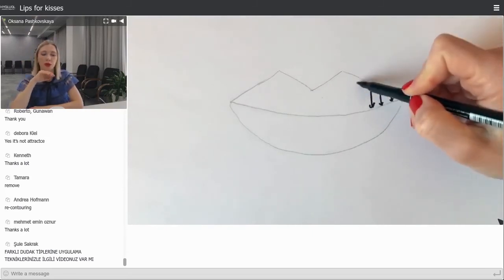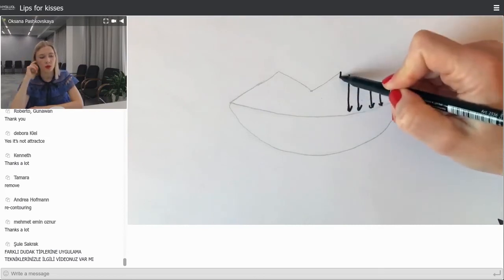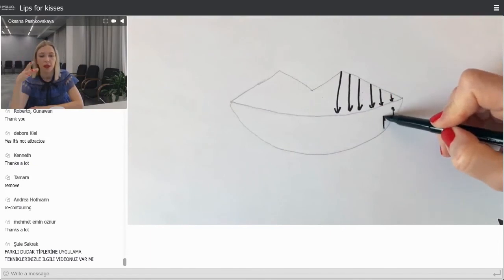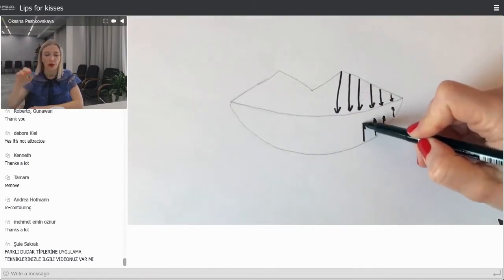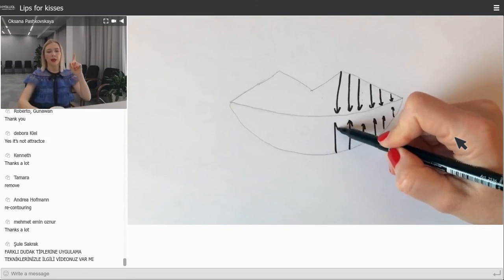It's my favorite, because when lips are full and you just want to reset their youthfulness and freshness, you use such a technique. One minute, I made a pause to explain something very important. When you inject through the contour of the lip, please go to the closure line.